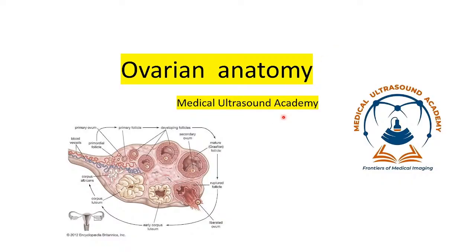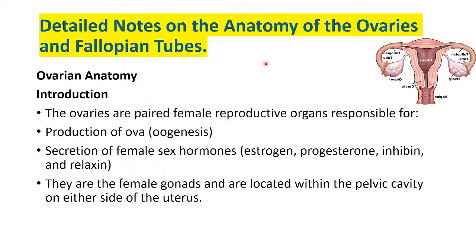So now we continue with pelvic anatomy. In this presentation, I'm going to discuss the ovarian anatomy, with detailed notes on the anatomy of the ovaries. We would touch on the fallopian tubes in the next lecture because it will be too long.